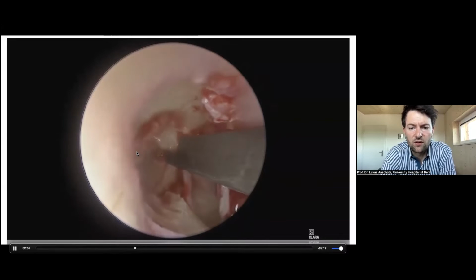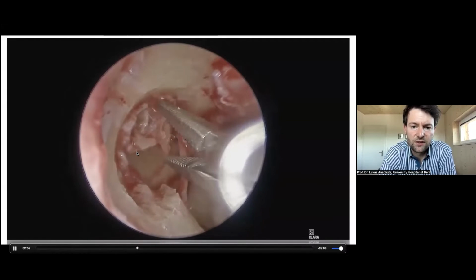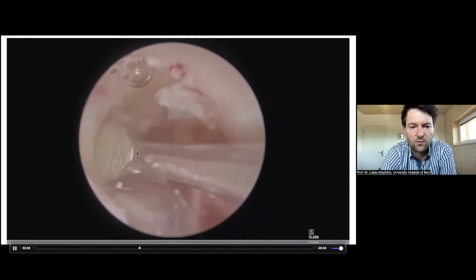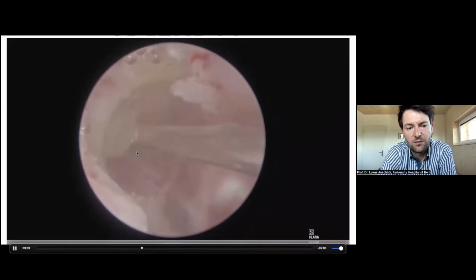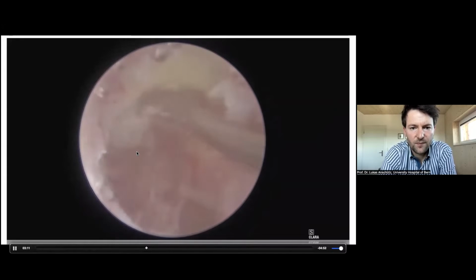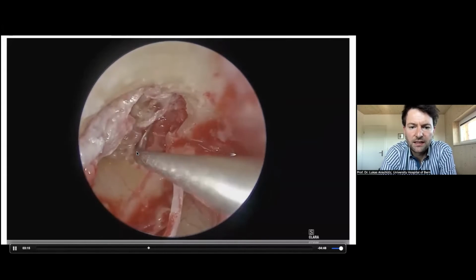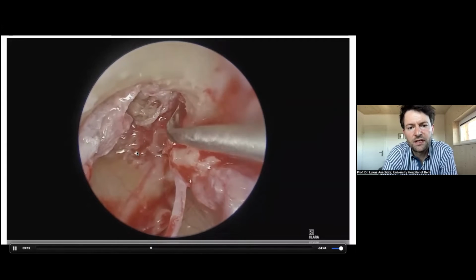Also the head of the hammer needs to be cut because the cholesteatoma is infiltrating anterior to the head of the hammer. We can then again make the approach a little bit larger to be able to really carefully dissect the cholesteatoma out of the middle ear. So you can see it goes very well, the removal of the bone. And now I search the plane for the cholesteatoma removal here.